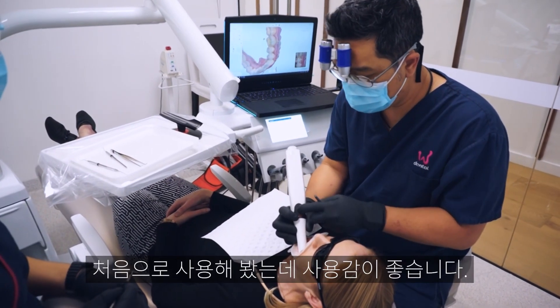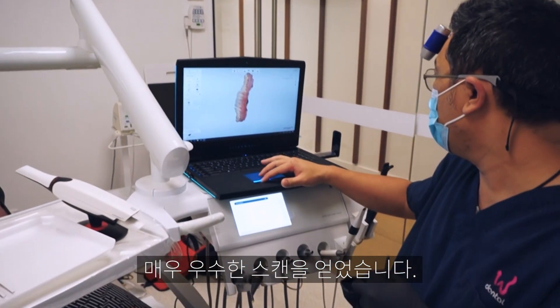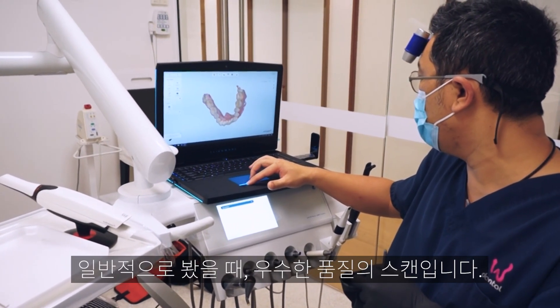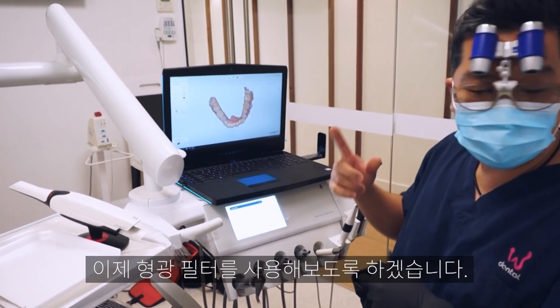Just over a minute — not too bad for our first try. Pretty good scan there; a couple of holes we can go through, but generally that's not a bad scan at all.